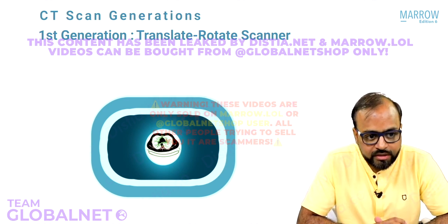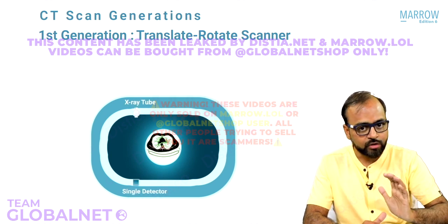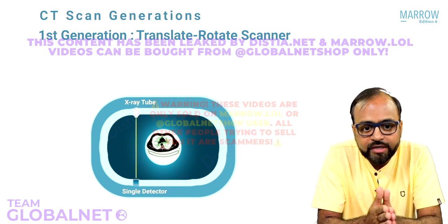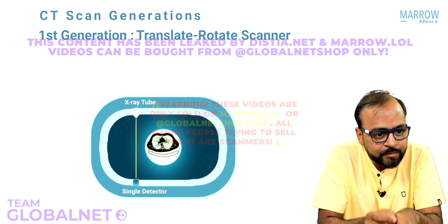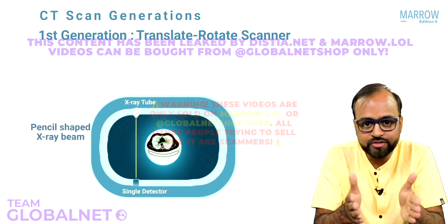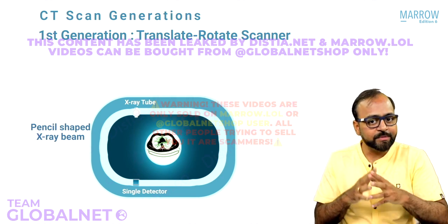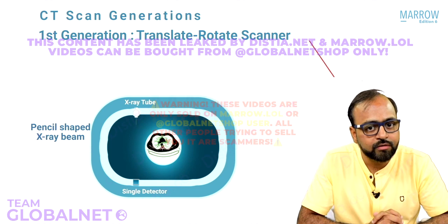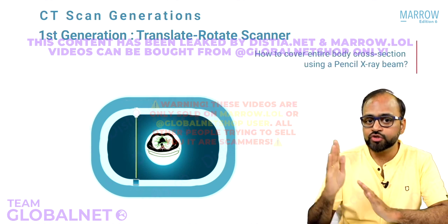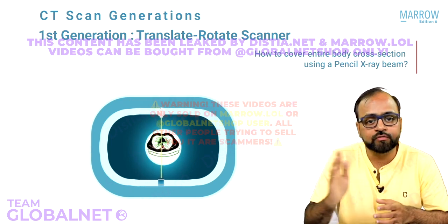How does it work? See, it has an X-ray tube and a single detector on the other side, diametrically opposite side. Look at the X-ray beam which is produced from this X-ray tube. It is a simple, linear, thin, pencil-shaped X-ray beam, right? That is a peculiar feature of first generation CT scanner. Now tell me, using such a thin pencil-shaped X-ray beam, how will I be able to cover the entire cross-section of the patient's body? Yes, for that, we'll have to swipe this pencil beam entirely across the patient's body from one side to the other.